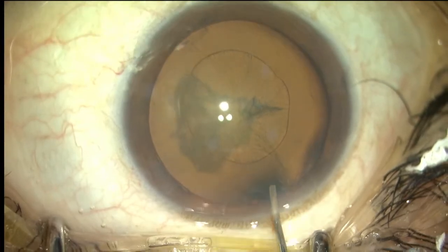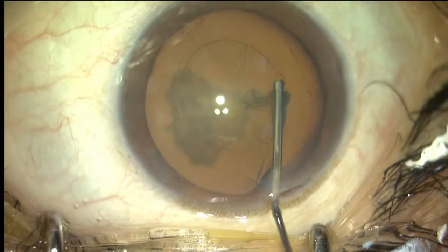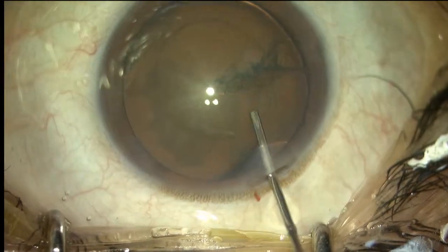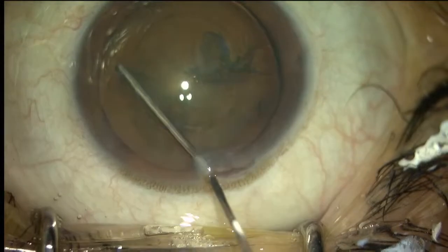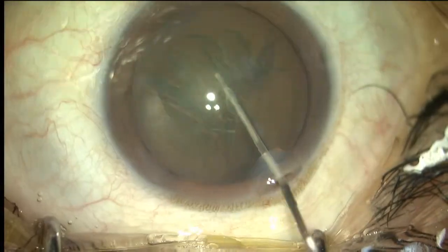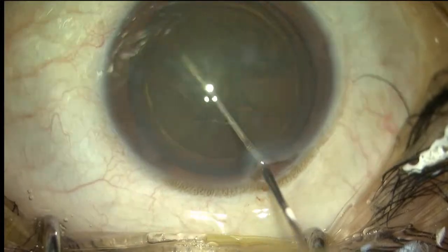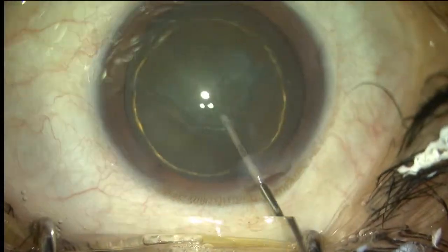So you need to evacuate the visco a bit and then take your needle a little below the capsulorhexis margin and go towards the equator and inject the fluid. So you can see the cortical cleaving hydrodissection, full dissection has been done, and see the fluid wave. I'll be doing hydrodelineation also. So this is the delineation. I've completely dissected the nucleus now.